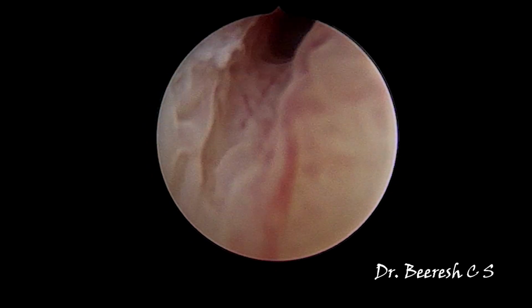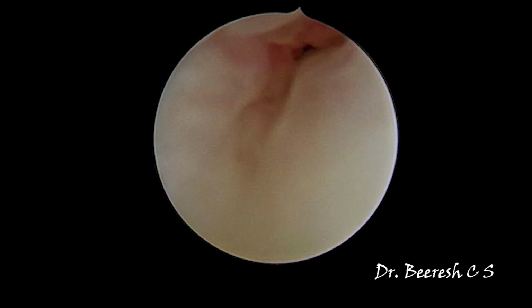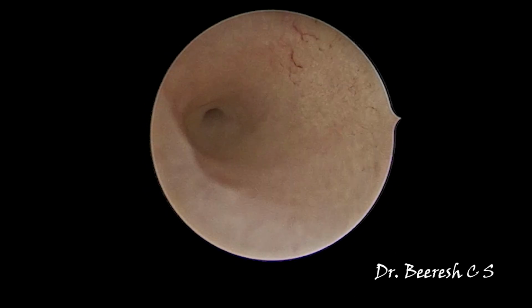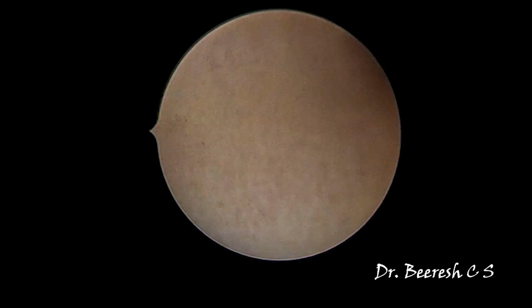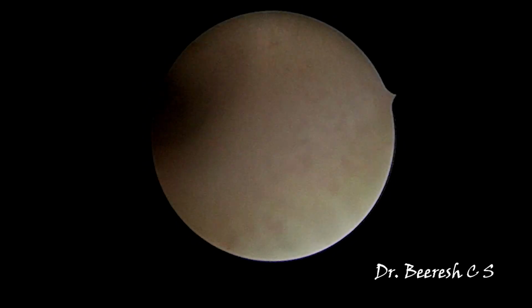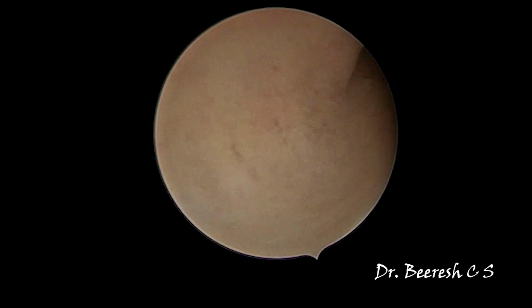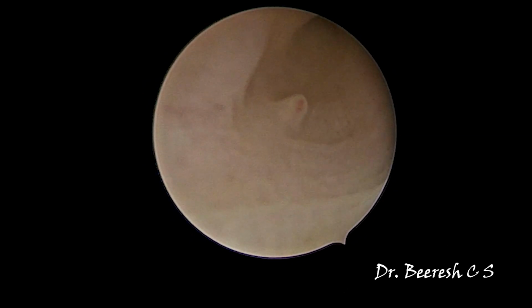Now we are entering the uterine cavity by vaginoscopic approach. Here we are at the level of the cervical canal, trying to negotiate the internal os. So that's the first view of the uterine cavity, which showed a narrow cavity, and the ostia are widely placed and not visible with the scope at the level of the internal os.